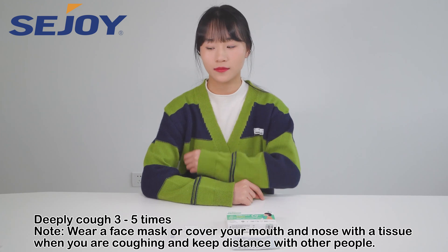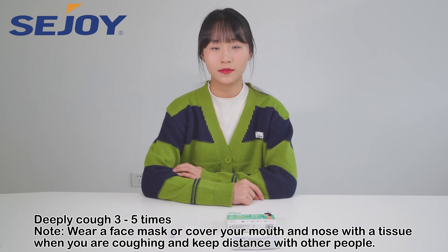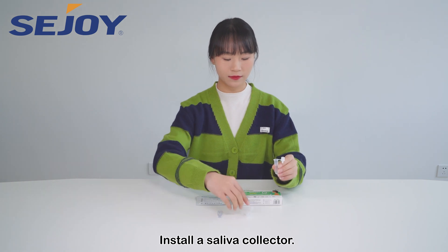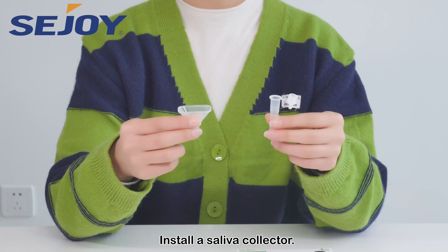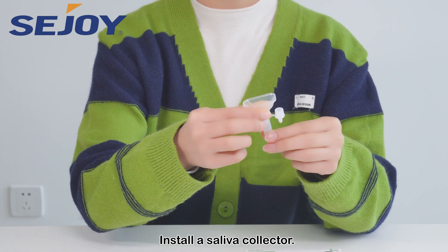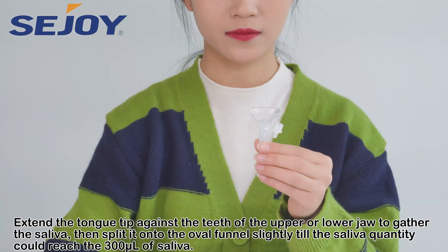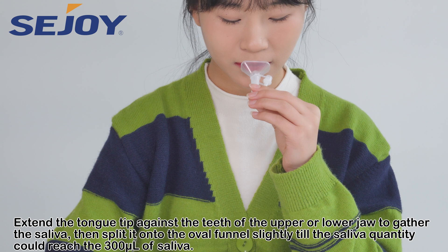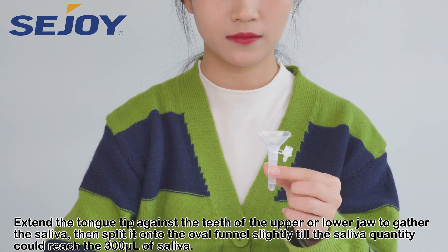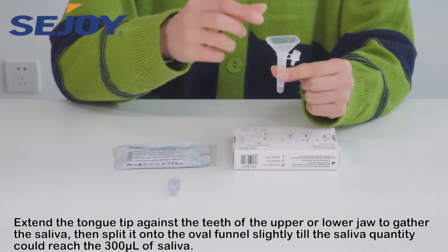Deeply cough three to five times. Install a saliva collector. Extend the tongue tip against the teeth of the upper or lower jaw to gather saliva, then spit it onto the oval funnel until the saliva quantity reaches the 300 microliter mark.